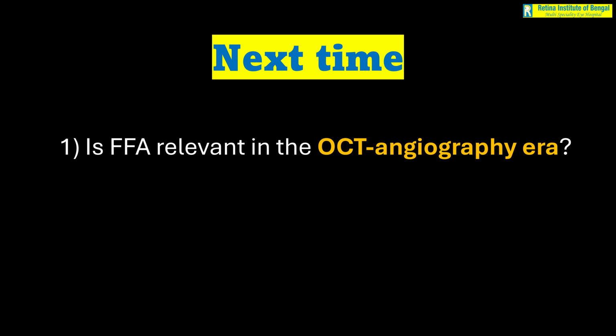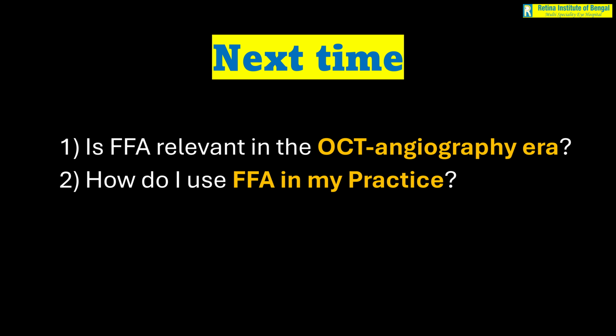So if that be so, do we really need to do FFAs at all in today's time? Or is it time for us to just bid farewell to the fundus fluorescein angiography machines? And if not, then how do we use FFA in our practice? So I will share my take on both these questions in the next presentation.